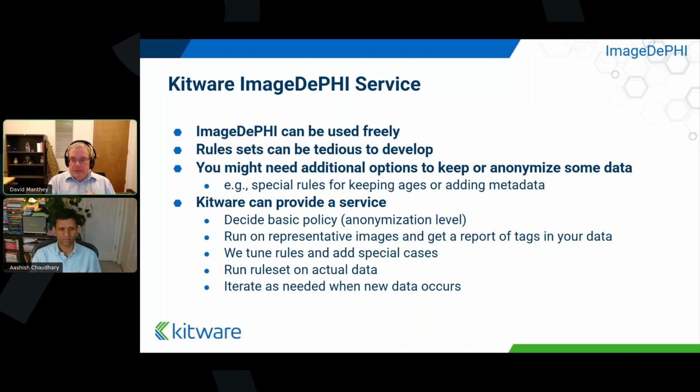You might need additional options to keep or anonymize some data. So if you have something you want to keep or inject, you say, hey, I want to add these tumor reference codes that are from my reference database to this data so that when I pass it into my machine learning pipeline, it knows what to do with it. This is something that can certainly be done.